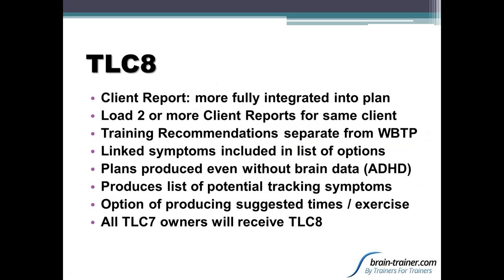That will be very integrated into the plan in terms of what your training is, not only based on what we see in the brain, but also the symptom patterns that the client's reporting. It will allow you to use 2 or more client reports for the same client. I can have dad and mom and Junior all fill out client reports for Junior, and that data will be combined.